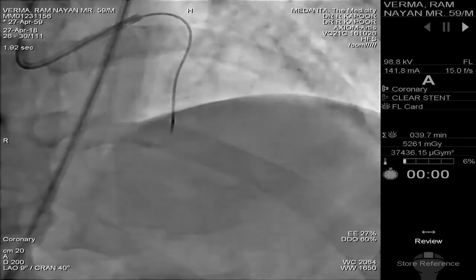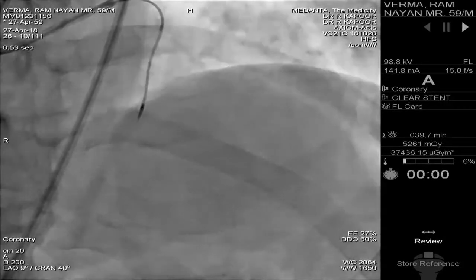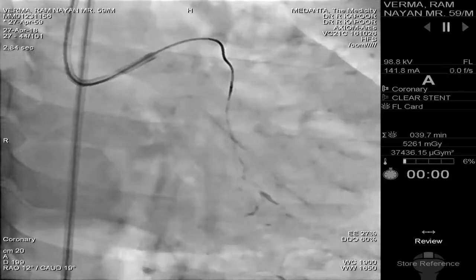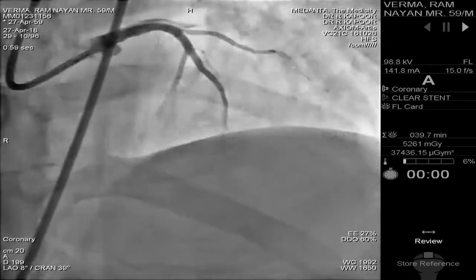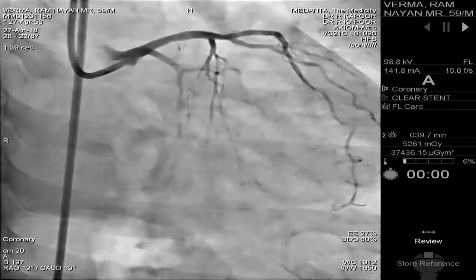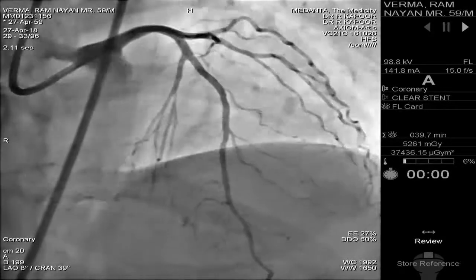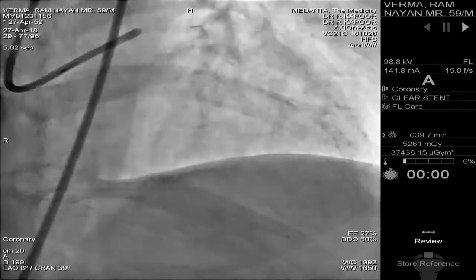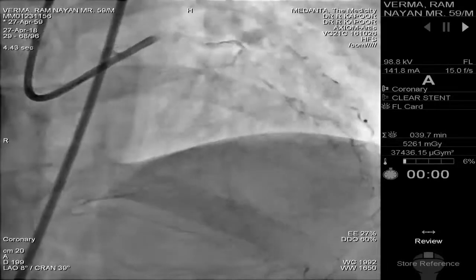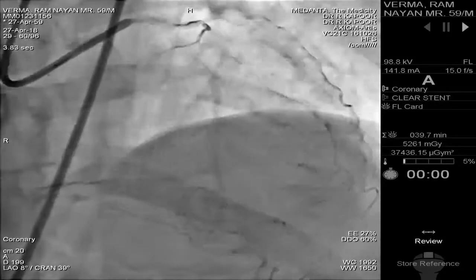But somehow we were not able to do so because there was no concrete channel through which we could enter the right coronary artery from a retrograde route. Then we tried the antegrade route also, but if you decipher the angiogram, there is a branch and it's a blunt occlusion. So we changed our plan and have another case now. This was our initial plan to discuss retrograde CTO. If there is any discussion on this, we can do that and then come to the present case. Okay, thank you very much.